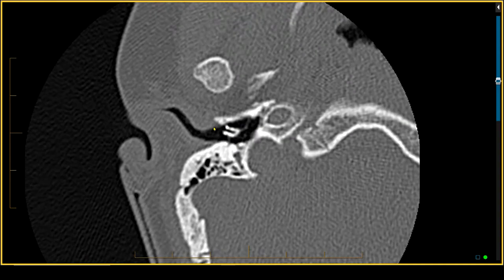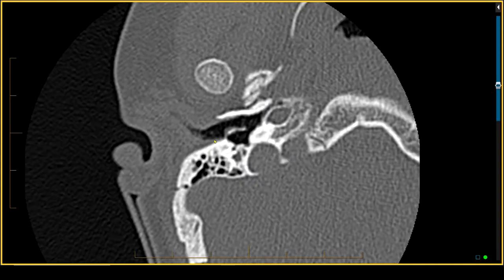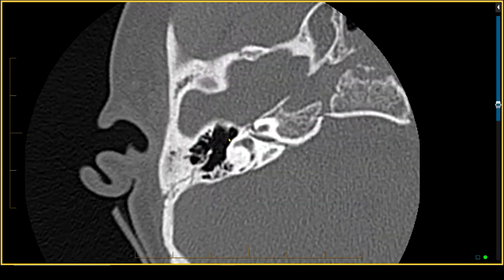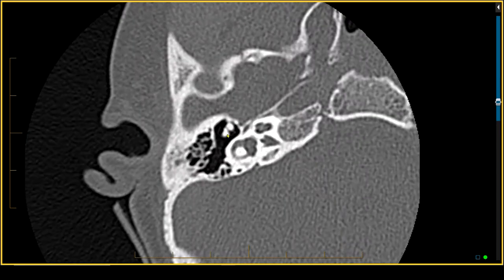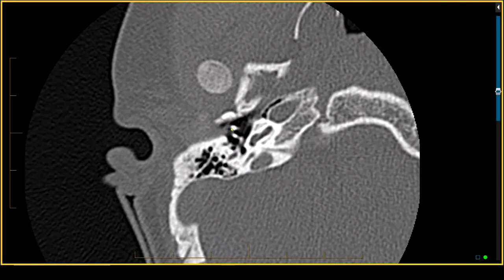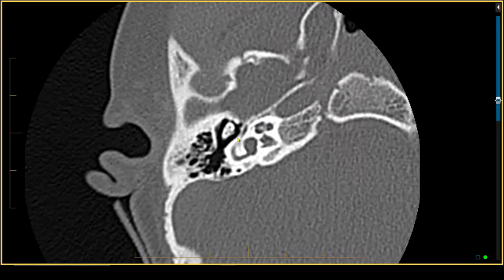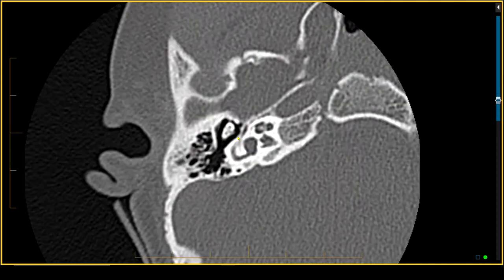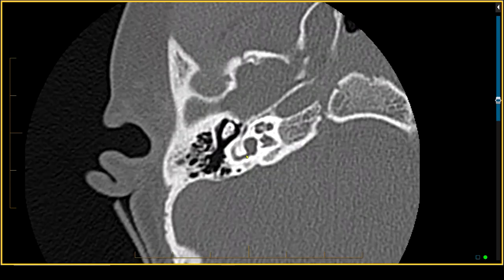The bony external auditory canal looks normal in its caliber. Looking at the ossicles, they look pretty good — there's the malleus, the incus, the neck of the malleus, the long process of the incus, the stapes footplate, and the incudostapedial joint. That all looks fine, so we can pass the middle ear.